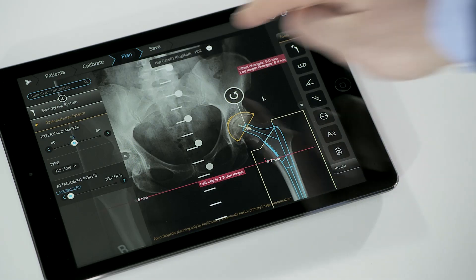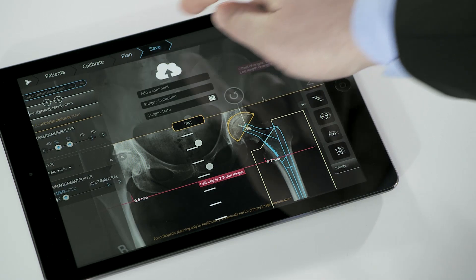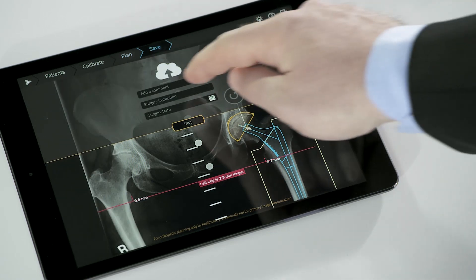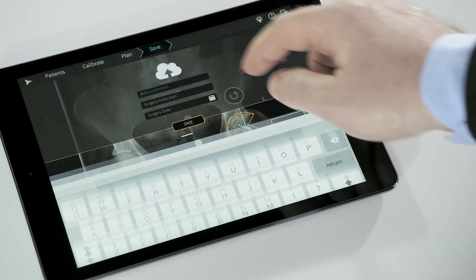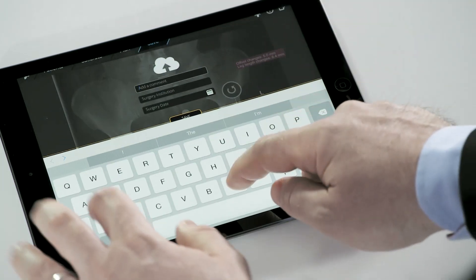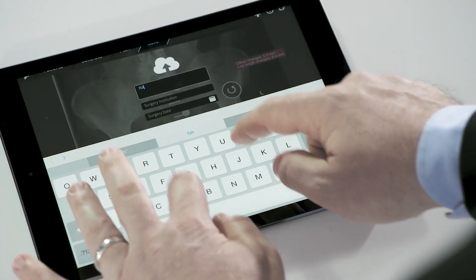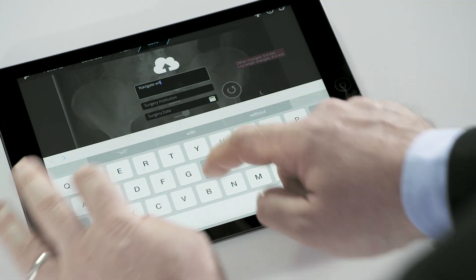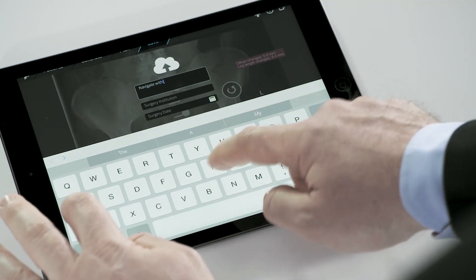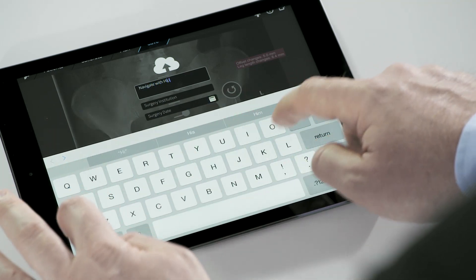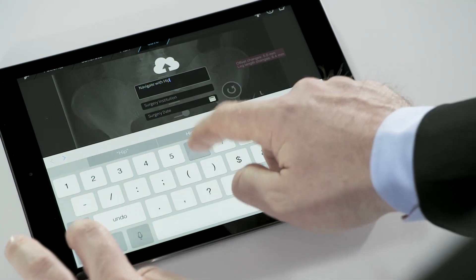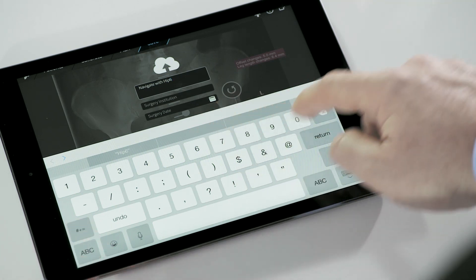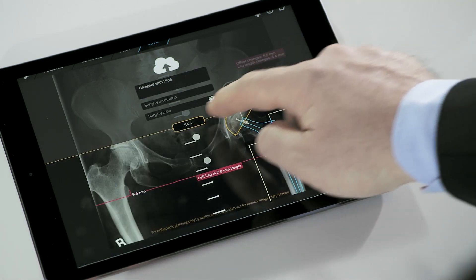Once the planning is complete, it is saved with the save tab. Additional notes can be added including comments, surgery hospital, and surgery date, and saved back to the PACS or to QUENTRY, where the information can be shared securely with colleagues or business partners.